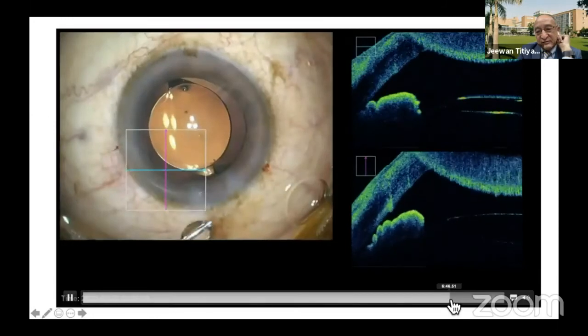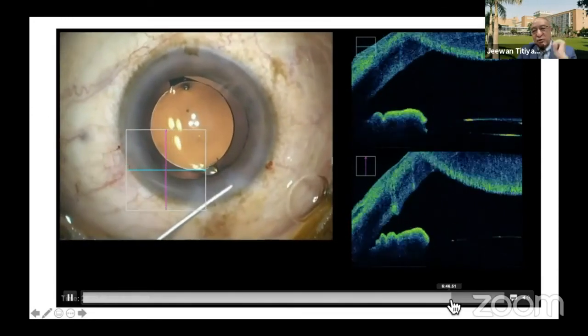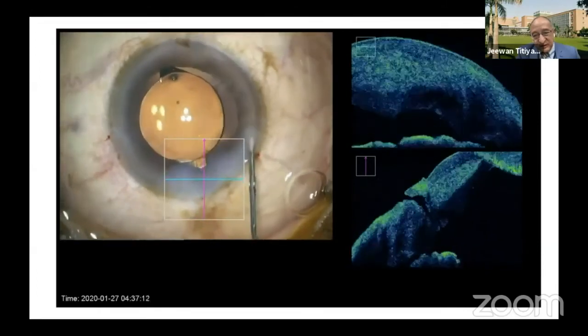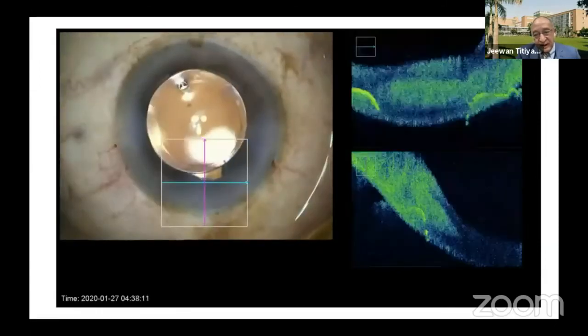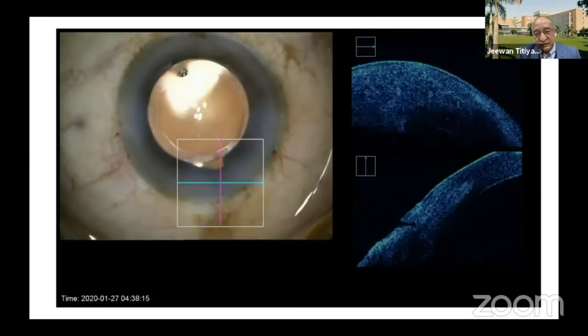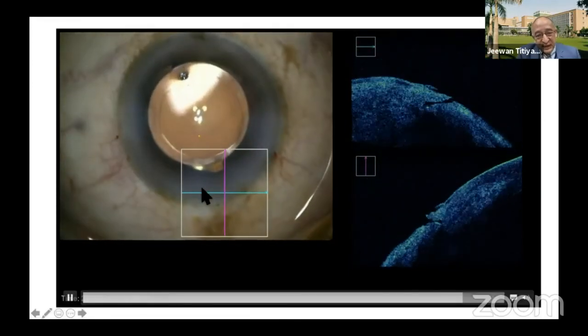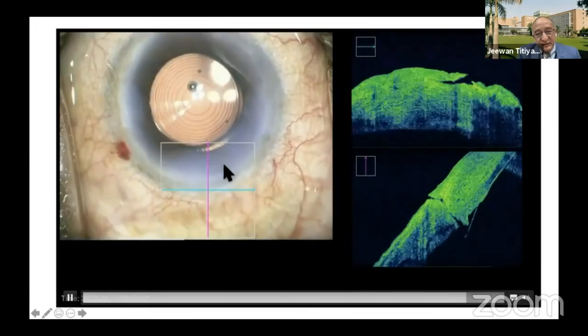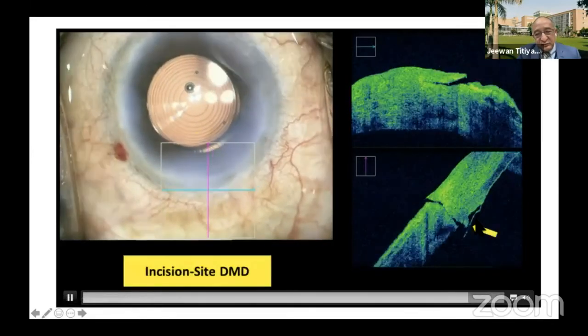Viscoelastic removal is simpler. Normally it doesn't require any assessment, but towards the end, it is very important to know in cases where you have a little bit of disturbance in the incision area, and in high risk cases, a Descemet's membrane detachment can be picked up during this stage also. Because after hydration, it is very difficult to see what is happening underneath the incision area. But if you see OCT, there's a little bit of disturbance in the Descemet's area.